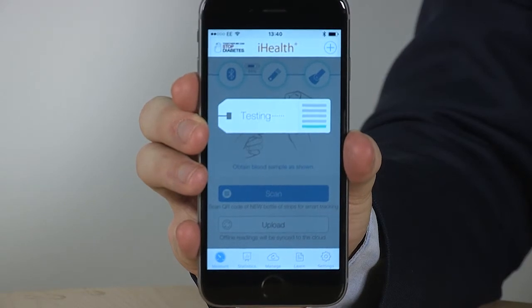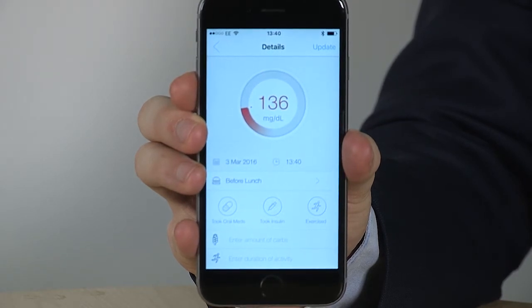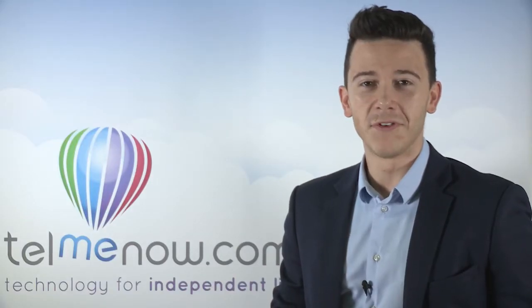After the five-second countdown, your result will be instantly added to the app via Bluetooth, and you can see if it's too high, too low, or spot on. Alternatively, if you haven't got your phone with you, your reading will just display on the meter.